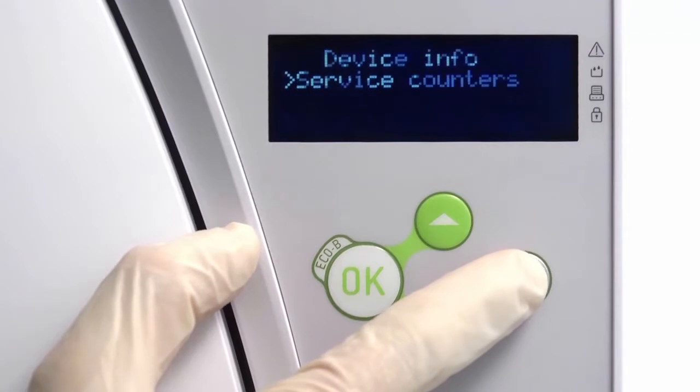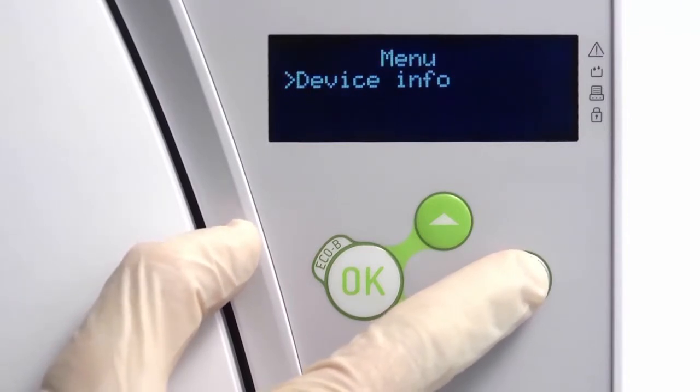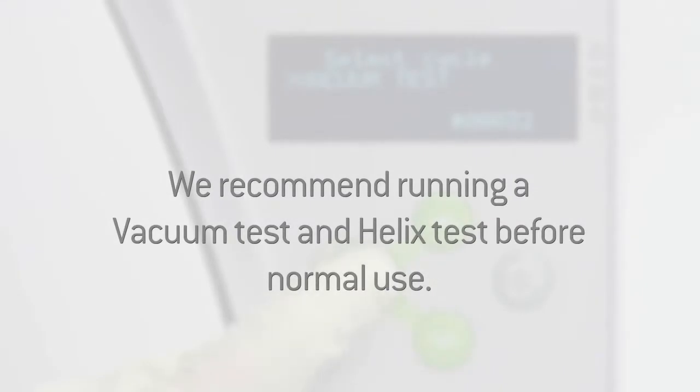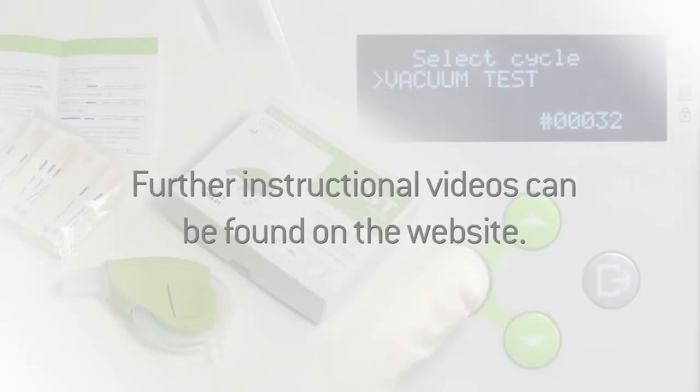Now navigate back to the Cycle Selection screen to return your Lina steriliser ready for normal operation. Once the new door seal is correctly fitted, it is recommended that a vacuum test and Helix test cycle be run before returning the steriliser to normal use. The successful test results should be recorded in a logbook. Further instructional videos for performing a vacuum test and a Helix test can be found on this website.